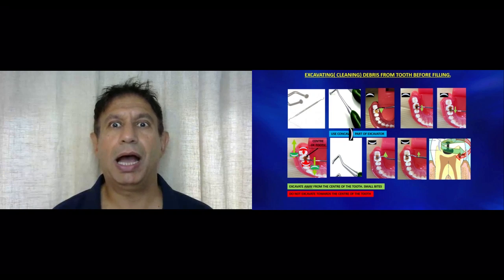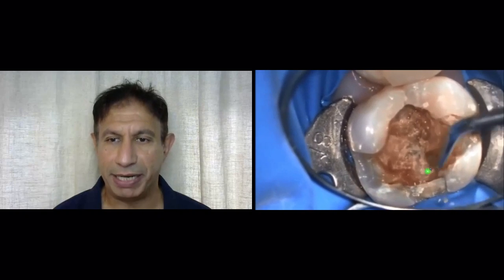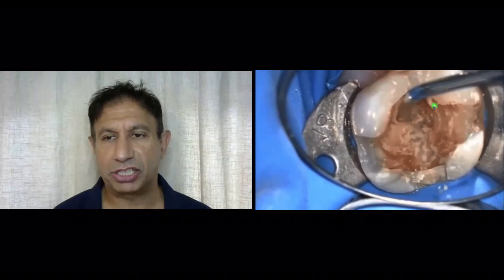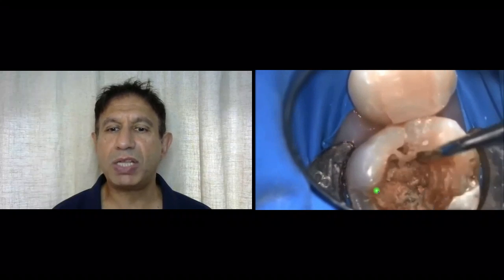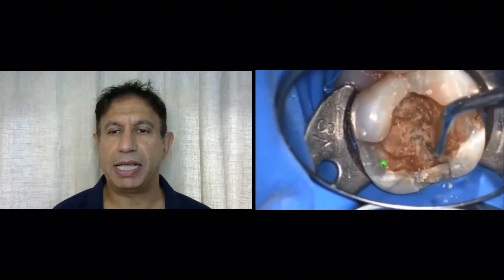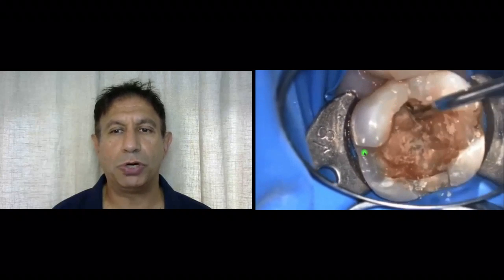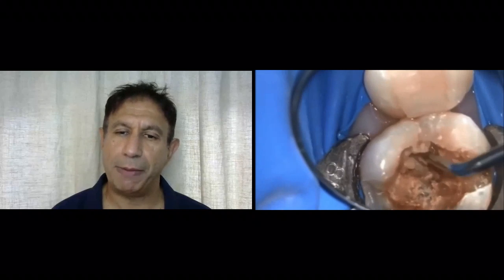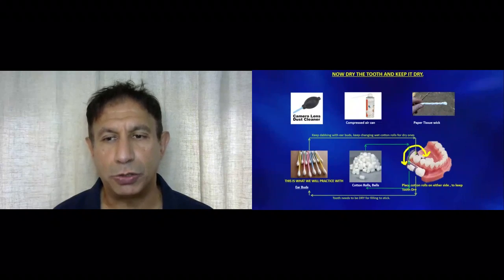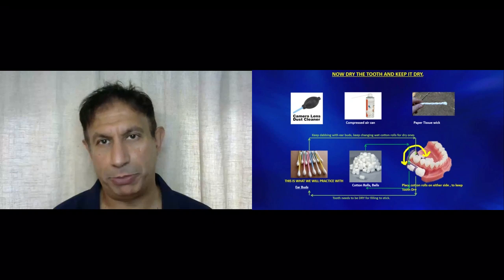As you can see in the video, it's being cleaned away from the center of the tooth. The consistency is like soft mushy cheese, then soft leather, with a variable consistency. We keep cleaning until it reaches the consistency of wood shavings and then stop and put our temporary filling in, because we want to make sure we don't enter into the pulp chamber.